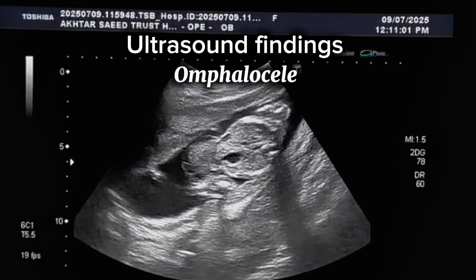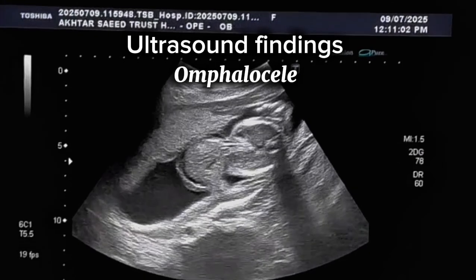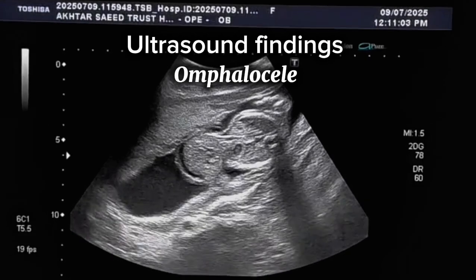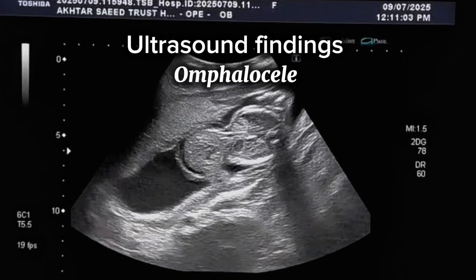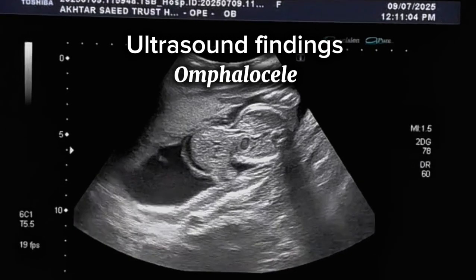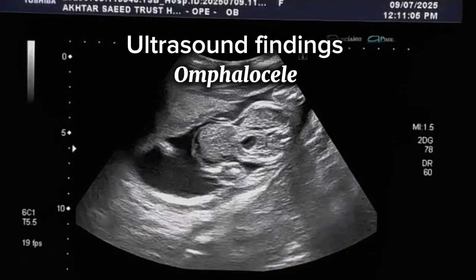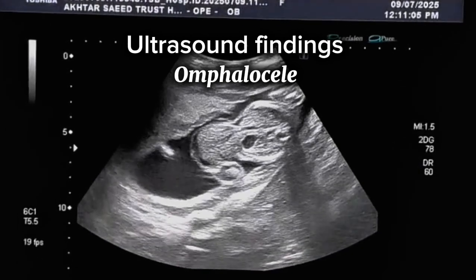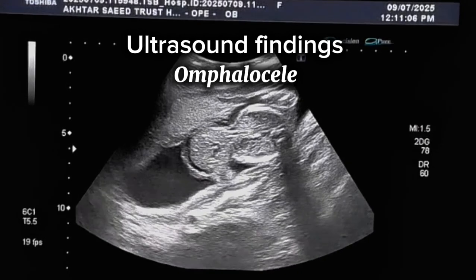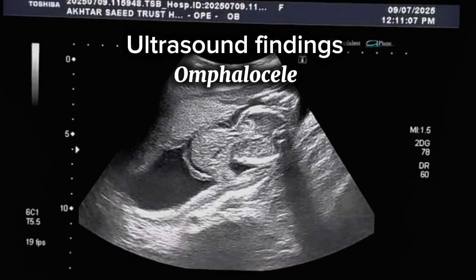The conclusion in this case is that it highlights a fetal anterior abdominal wall defect, which is omphalocele with moderate ascites and bilateral clubfoot without limb shortening or liver herniation. Timely diagnosis, genetic evaluation, and multidisciplinary care planning are essential for guiding prognosis and parental decisions.